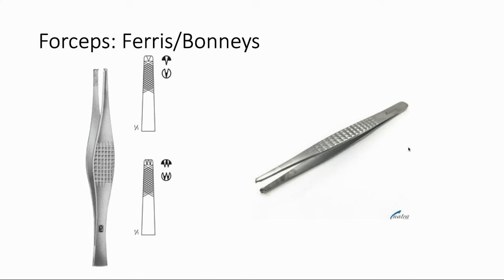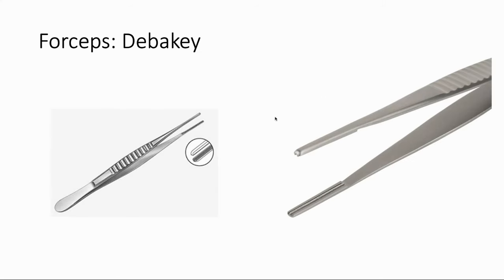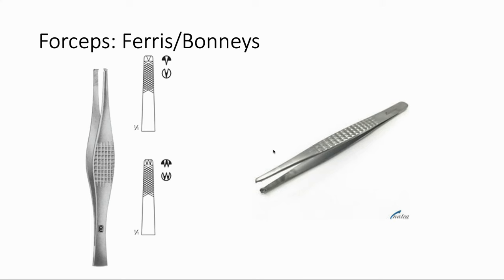Another forcep — called either Ferris or Bonnie forceps depending on your institution — is essentially a really big, heavy-duty version of tooth forceps. You can see the teeth, and they're used for grabbing heavy fascia, like when we're suturing closed the fascia at the end of an abdominal operation. You'll see a theme: the Adson's is the small delicate instrument, there's a middle-of-the-road version, and then the heavy-duty Ferris for fascia. For a lot of surgical instruments you'll see three versions — one for fine work, one for everyday use, and one for really heavy-duty stuff.